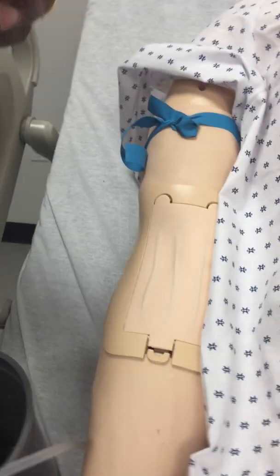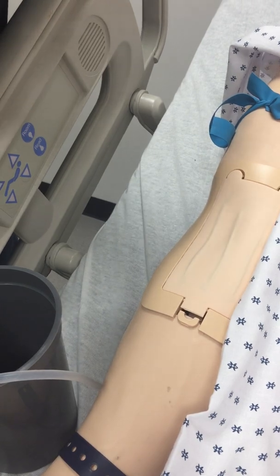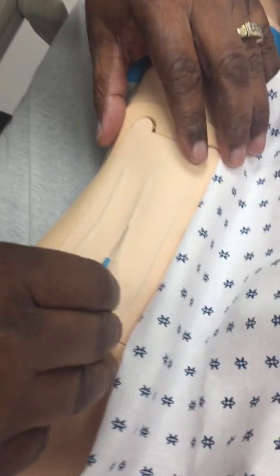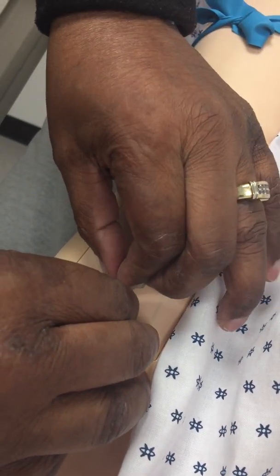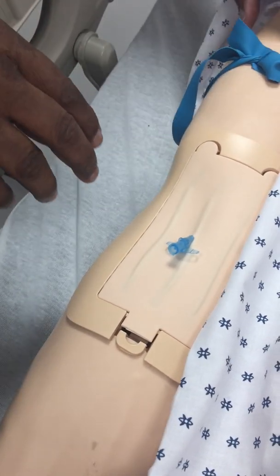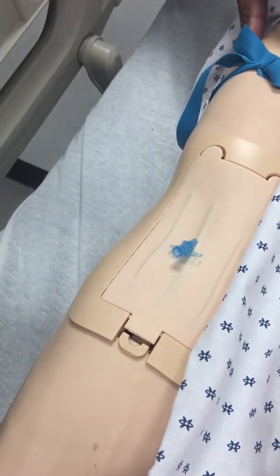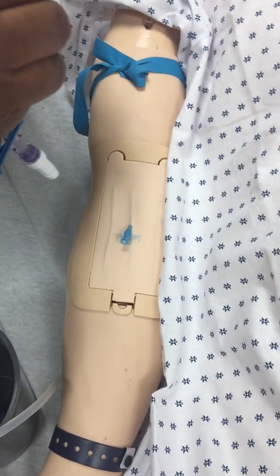I'm going to do a quick stick. We can cannulate this one here. I'm left-handed, so I did that with my right. You see that? You got the backflow, so we know that we're in. Then I'm just going to put a regular extension set on.